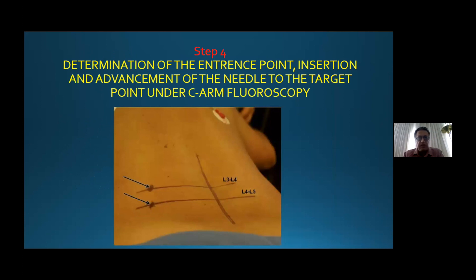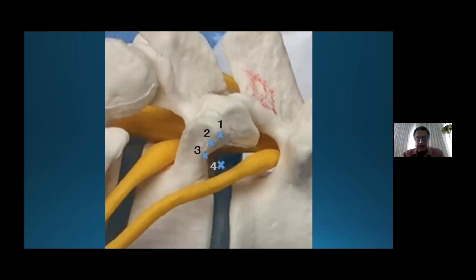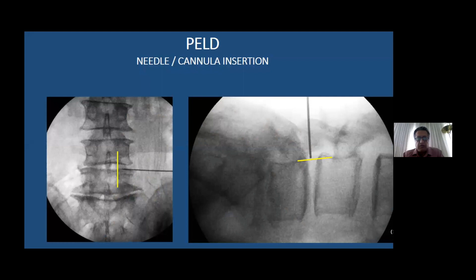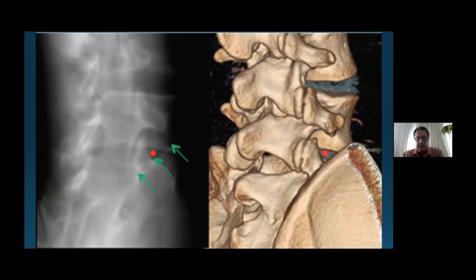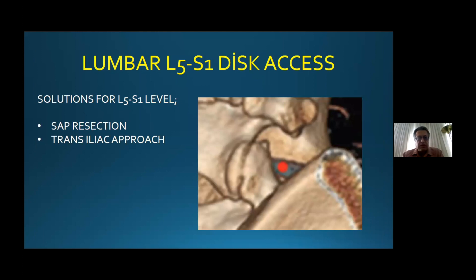Step four is the determination of the entry point. For inside-out technique or outside-in technique we have different targets. Before needle insertion and canal entry, we must have both AP and lateral views. For outside-in technique, we must be sure — it's a little more difficult and different than inside-out — that we are on the tip of the SAP. L5-S1 for the transforaminal approach is sometimes difficult, and we have different solutions: SAP resection or a transiliac approach.